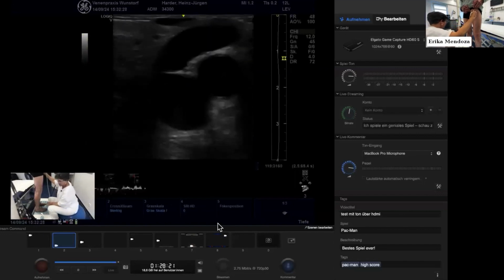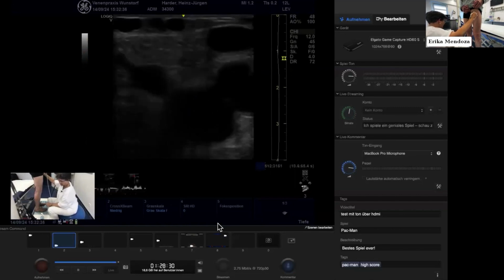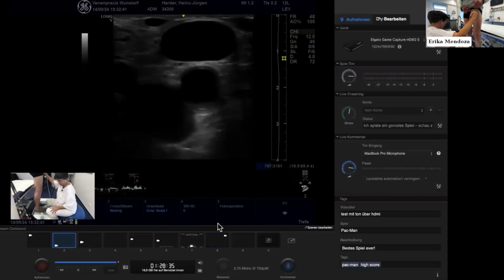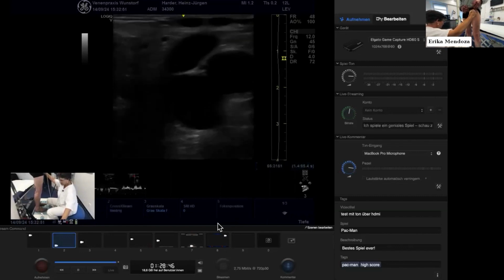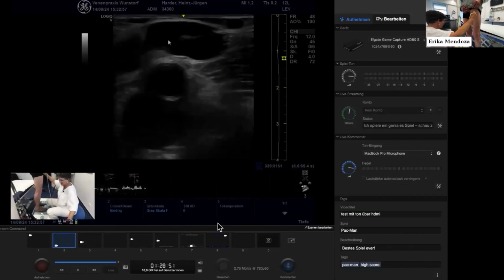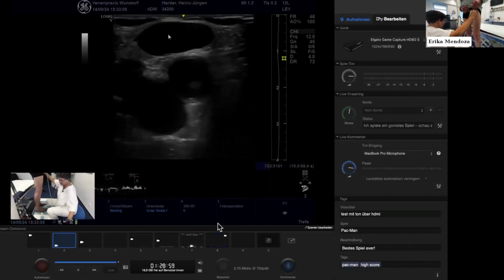So if a person carries these kind of very extremely tortuous varicose veins so many years in a country where all the thing we do is operating, you can imagine that he didn't want a surgery. And this is why he came here, because he knew that I'm doing it different. So I am completely with you, Joseph. You are thinking this one would be a wonderful case of putting adrenaline around the vein, and I'm thinking of doing it anyway. Because with adrenaline, you could reduce the volume of this.